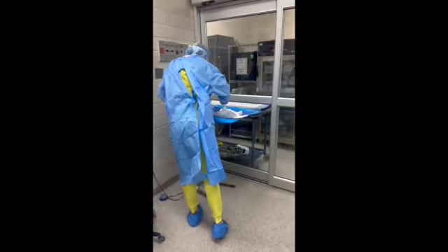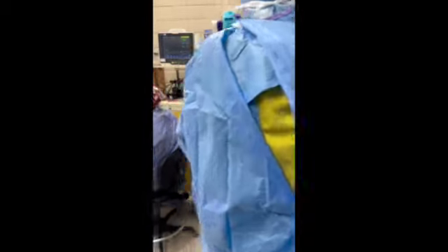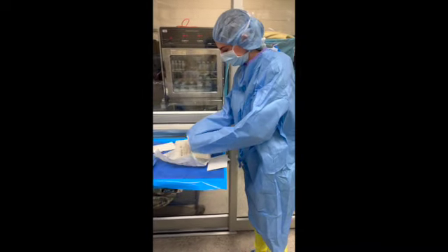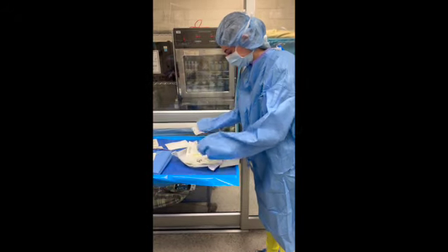Excellent. Our oxygen hose, that's all over our machine. You want to hand that to me. The oxygen to me. Yep. And I will connect this to the wall. And then we can turn off our AC. Okay.